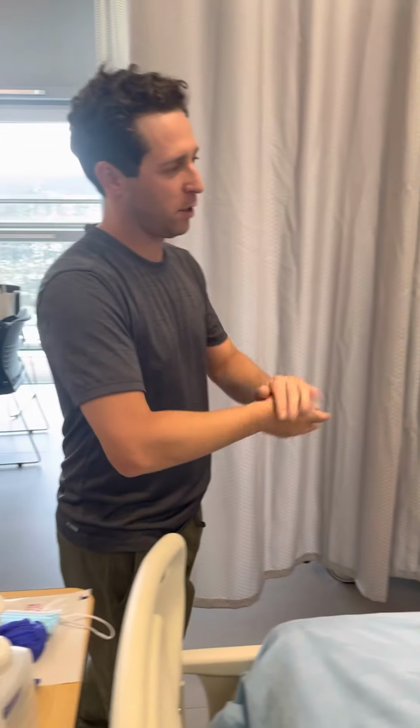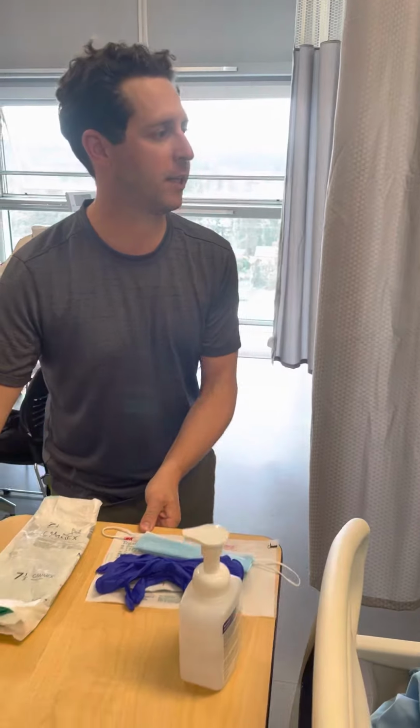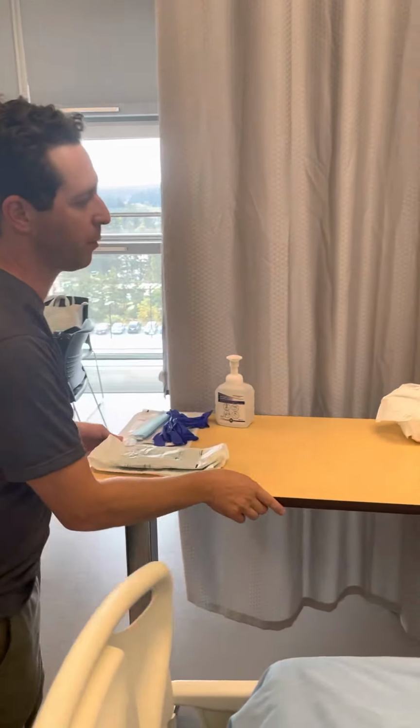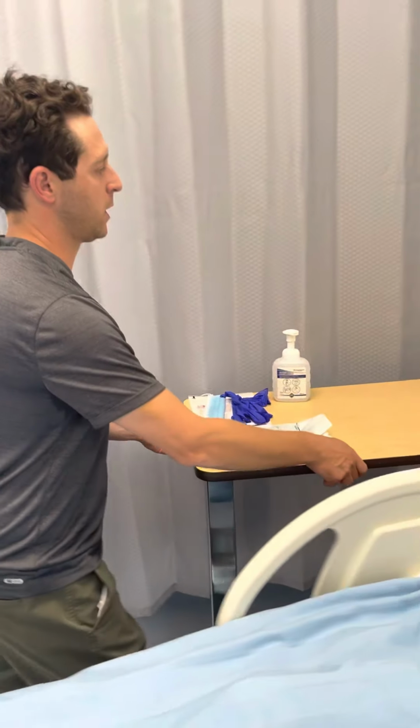Hi Pat, my name's Sean. I'm a third-year student. I'm going to be doing your dressing change for your CVAD today. Is that okay? Great. And this is closed behind me for privacy. Great, Pat, I'm just going to get set up.